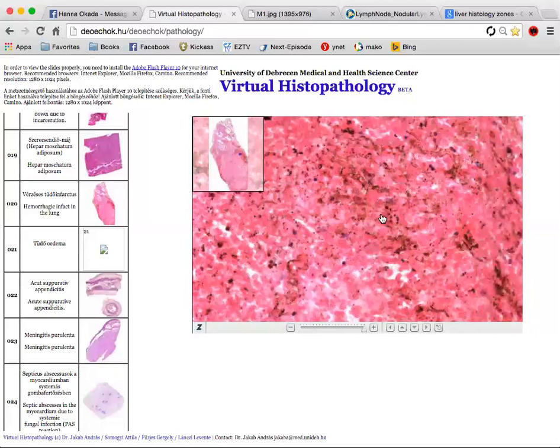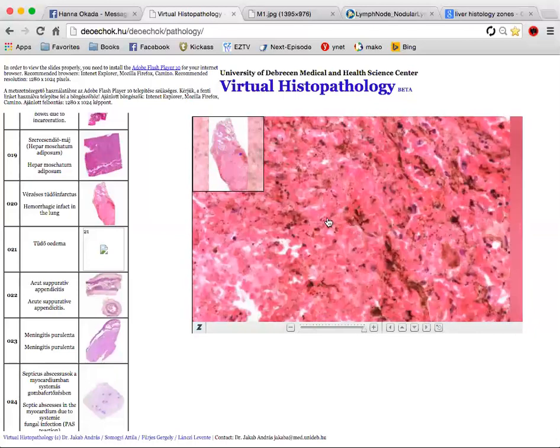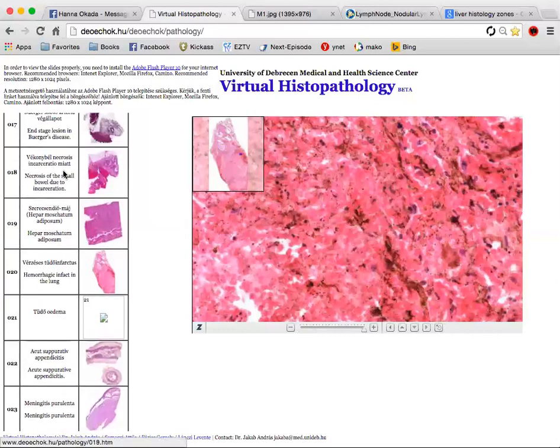Spleen, okay. And the previous slides, I don't know which slide, but you showed us the red infarct in the small bowel, right? In the intestine, yeah, this one, it's 18. The intestine has a dual blood supply.